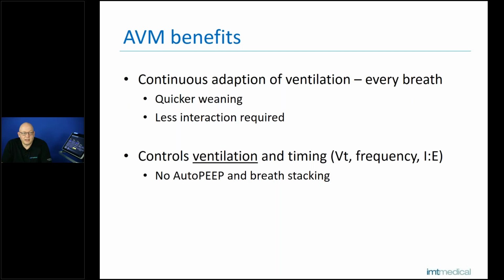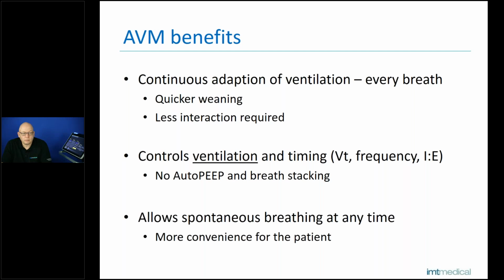It controls the ventilation and also the timing, so I don't have to set here the tidal volume or the respiratory rate or the I/E ratio, because the patient is always observed by the ventilator. The only thing I have to look at is the CO2 level and the set minute volume. And of course, during AVM ventilation, the patient can breathe at any time he wants, and he can set the ventilator from spontaneous to mandatory, mandatory to spontaneous, just depending on the patient's activity.